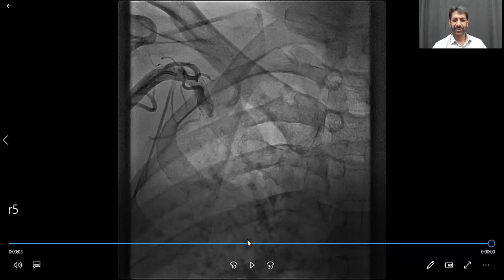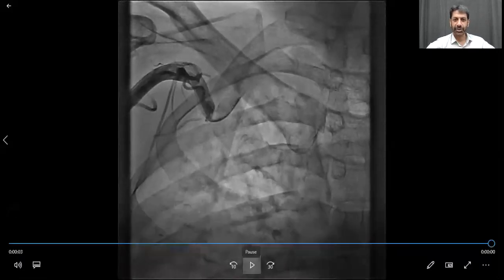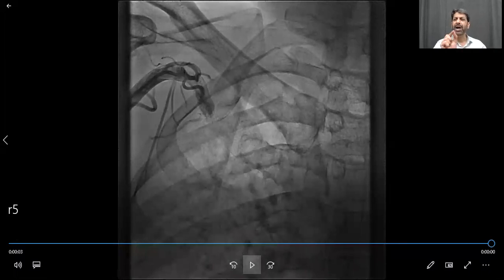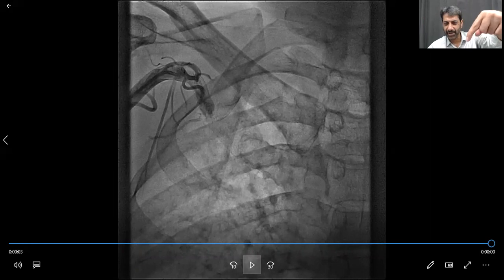And here, after taking an injection, he has seen that there is a tortuosity, a bend, with maybe a minor occlusion, or it may be totally a bend. So at this bend area, what you have to do is overcome it by passing a hydrophilic wire. A hydrophilic wire can overcome these issues, but even after passing a hydrophilic wire, then exchanging it with a hard wire, sometimes you may have difficulty in doing your procedures.